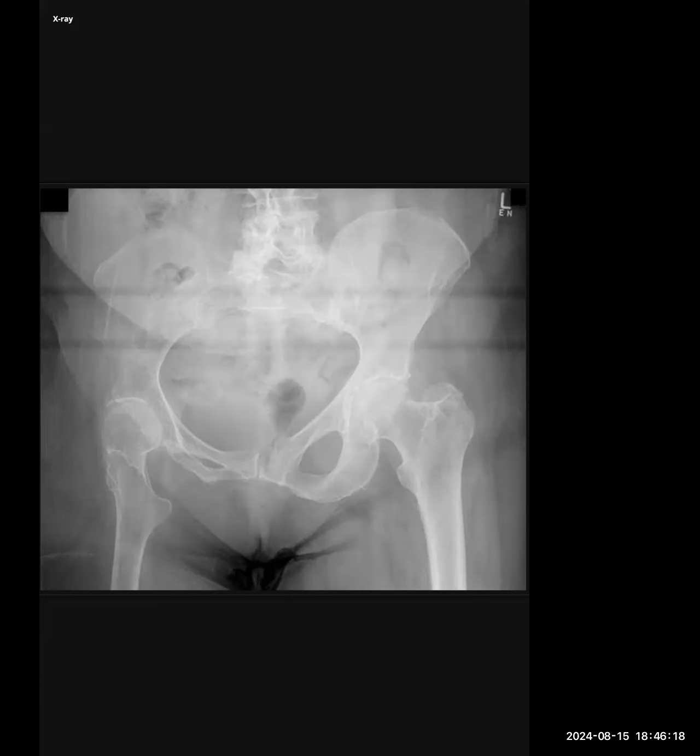I would inform these findings to the referring team and would compare with the previous radiographs. And this patient will be referred to the neurology and the orthopedics department for further management and an MDT discussion to decide the further course of management in this case.